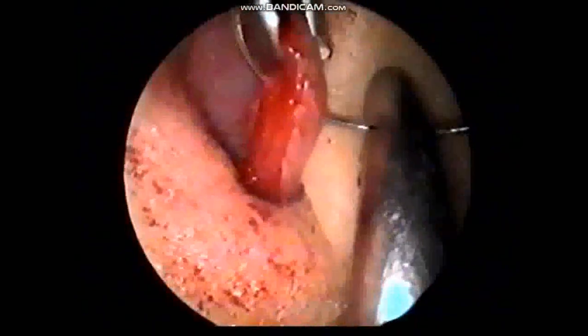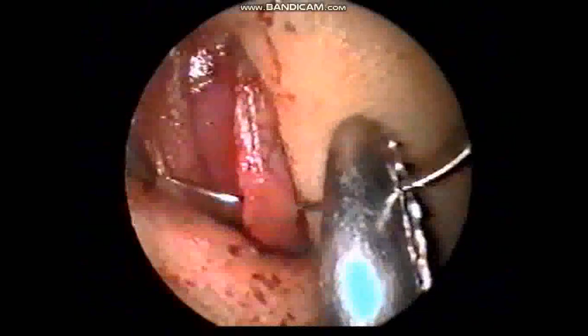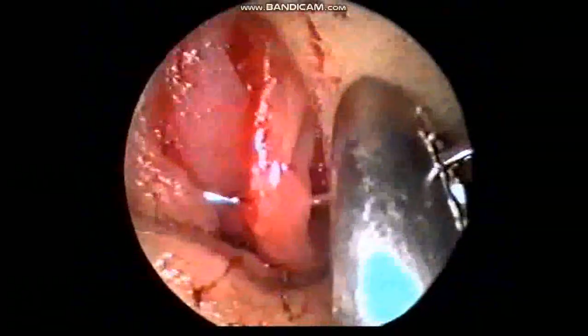The two knots are seen clearly. And the mucoperichondrium is tightly adherent to the septal cartilage. And both sides mucoperichondrium is intact. Wound is closed. We can see the anterior incision.